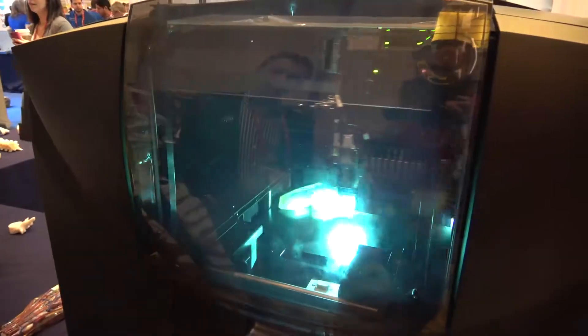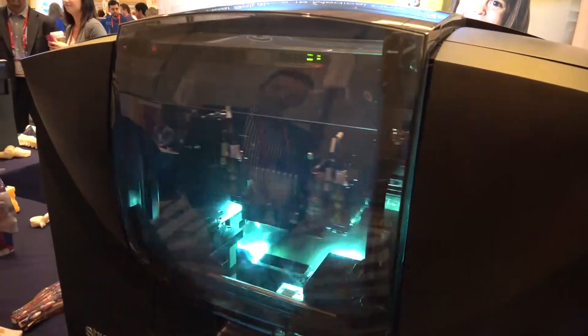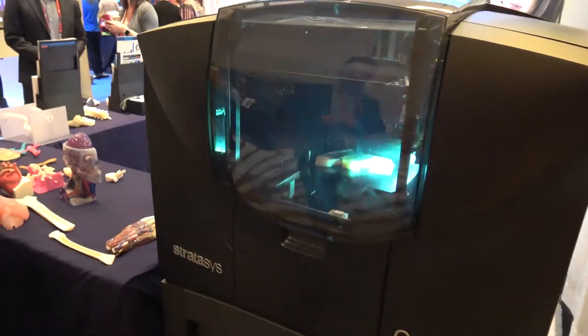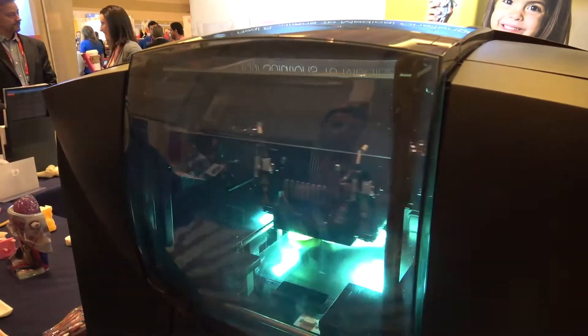There is an ability to mix materials together on the fly, to get different material properties or different flexibility and colors. This specific machine takes three materials at the same time. The top-of-the-line machine takes up to six materials at the same time, which enables full color or the use of transparent and opaque materials simultaneously.